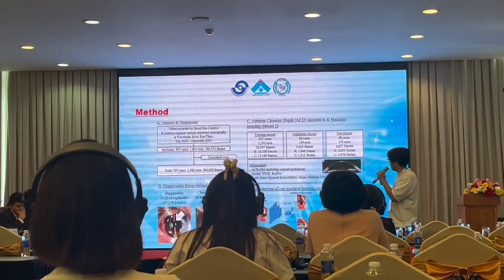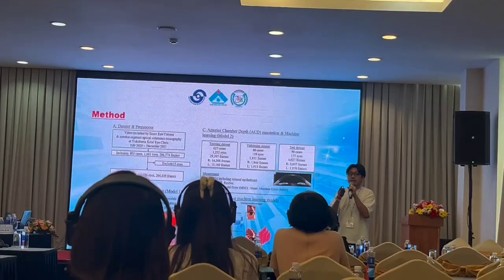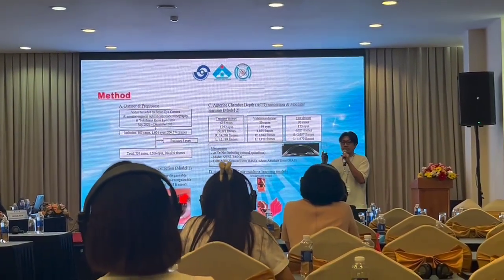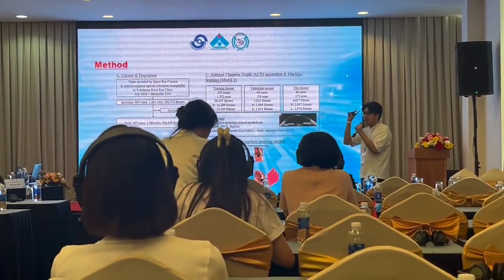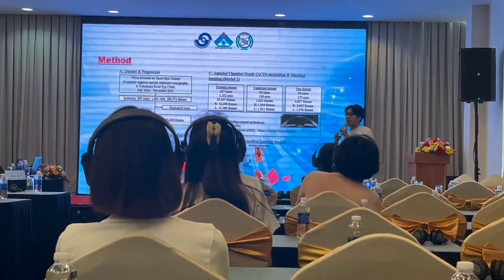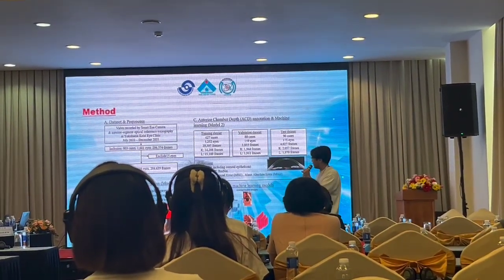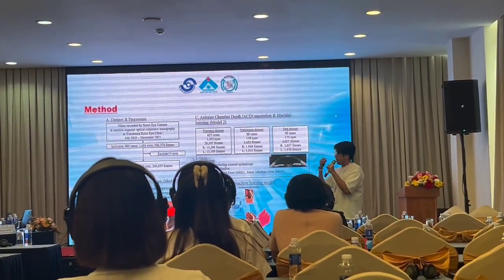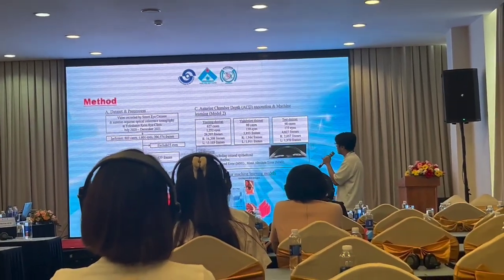If we see the central part of the anterior chamber, we can, of course, see the anterior chamber depth. But if the frames are not focused on the cornea, for example focused on the eyelid, we could not use them. So we made two AI models. One is to extract the diagnosable frames, which can easily visualize the central part of the anterior chamber, and exclude all other frames, which are not focusing on the anterior chamber, eyes closed, or any other occasions.